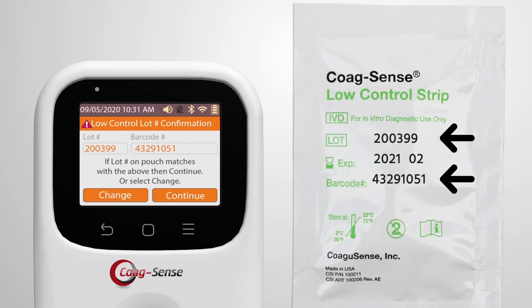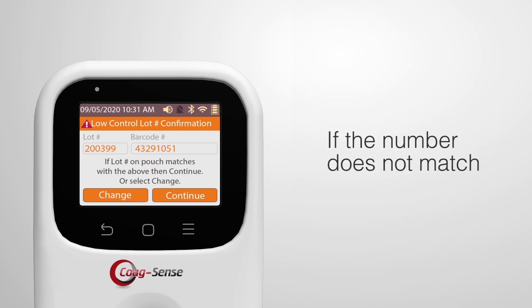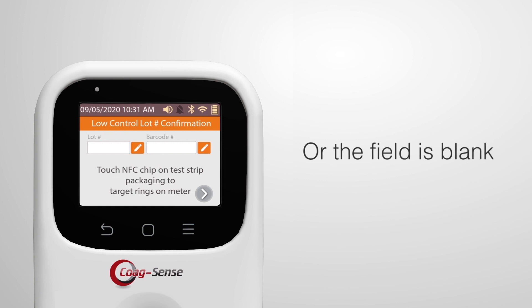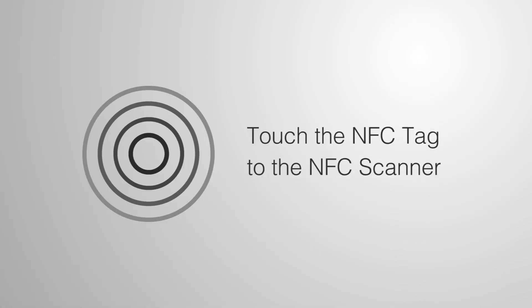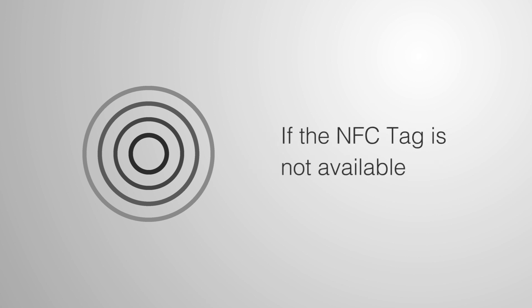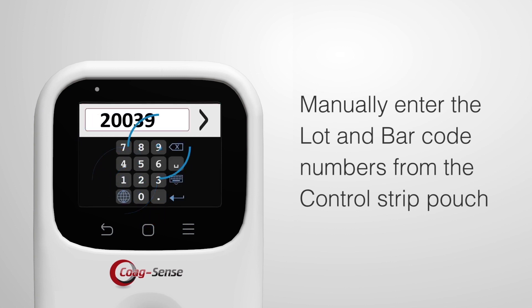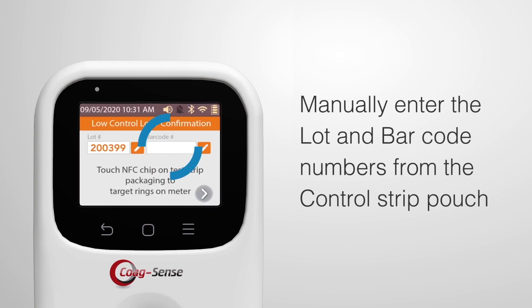Confirm that the control strip lot number on the display matches the lot number on the test strip pouch, then press Continue. If the number does not match or the field in the meter is blank, touch the NFC tag to the NFC scanner on the meter. If the NFC tag is not available, manually enter the lot and barcode numbers from the control strip pouch.